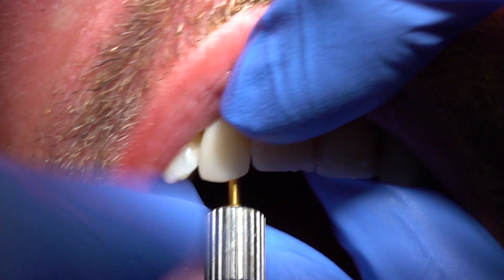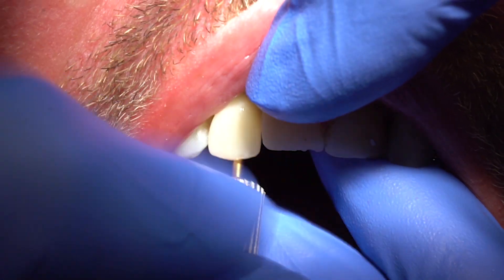Let me explain this by drawing a diagram — my favorite diagram of a front tooth. If we cut it in half and look at the bone around the tooth, when you take the tooth out you're always going to lose the bone around the front. That means the new bone position is a little further back, so the implant has to be placed further back and often tilted back a little bit as well.